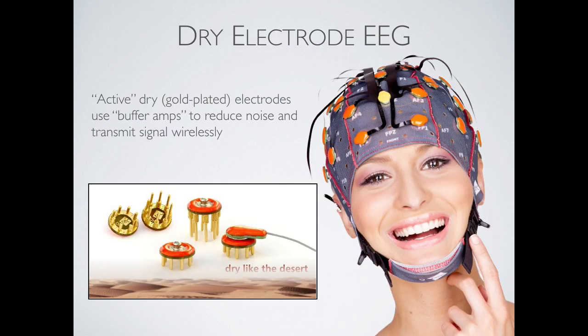There are also some of these dry electrode systems that you might hear about. I'm sorry, I saw some hands go up. I'll keep looking, it's okay. These systems are nice for ease of use. You can just put them on. There's some work actually being done here in the Boston area looking at something called a STAT EEG. In the emergency room, a neurologist might want to get a quick brain read, and systems like this that don't require that conductive gel under each lead can be applied very, very quickly. So that's one area that people are looking into to make EEG expediently accessible in an emergency situation.